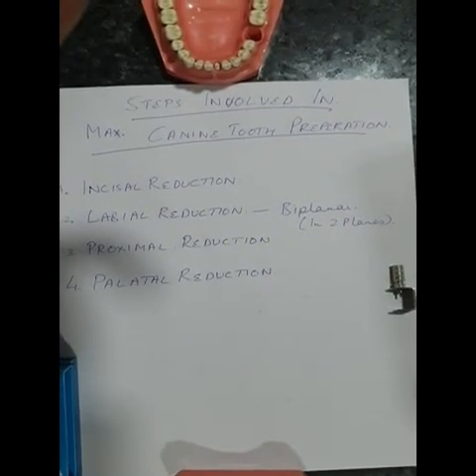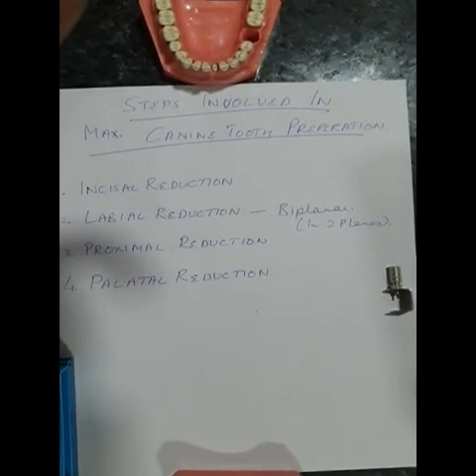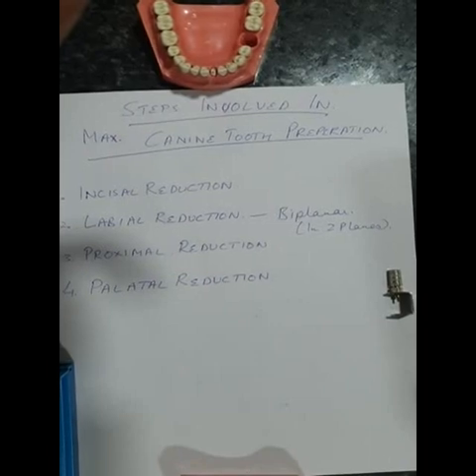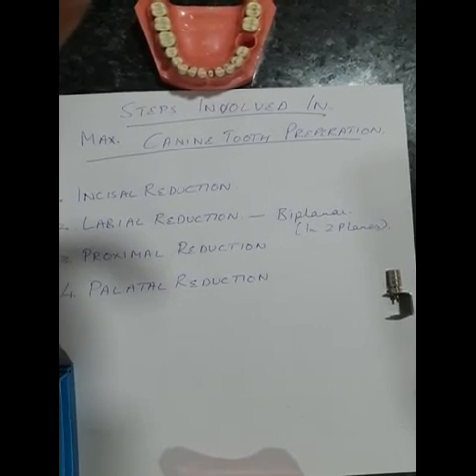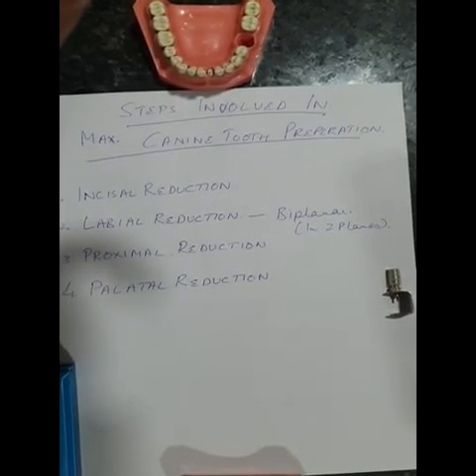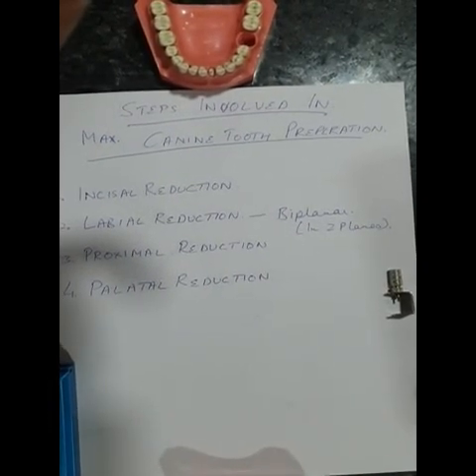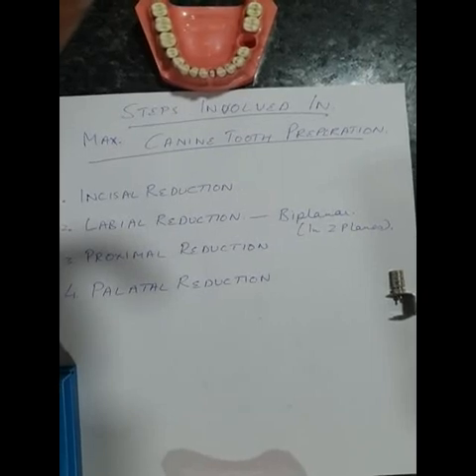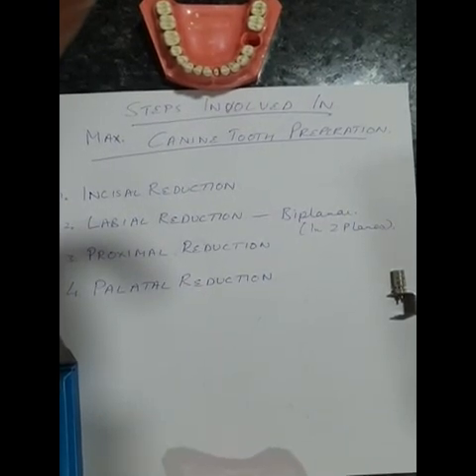Once you have finished the incisal two-third reduction, in the cervical one-third region you must follow the cervical margin — it should never be in a straight line. It should follow the CEJ (cemento-enamel junction), be curved, and the curvature should rise till the interdental papilla on both sides. By doing so, you raise your bur on the mesial as well as distal side till the upper border of the cervical one-third. Your finish line will not be in a straight line; it will be in the form of a smiley.